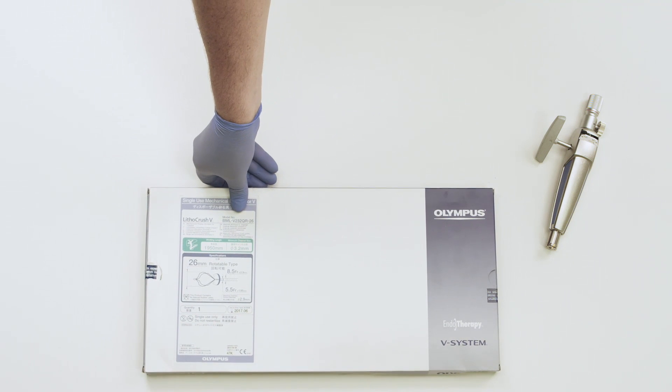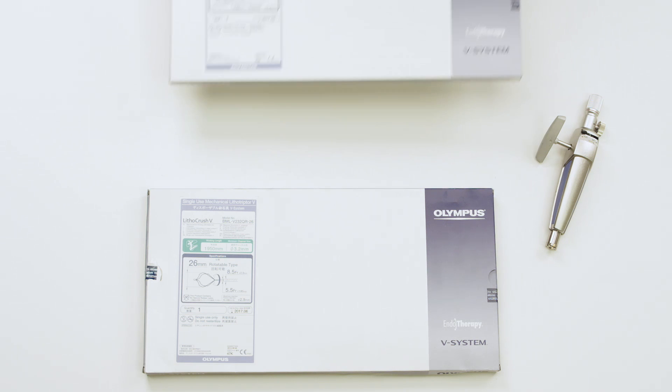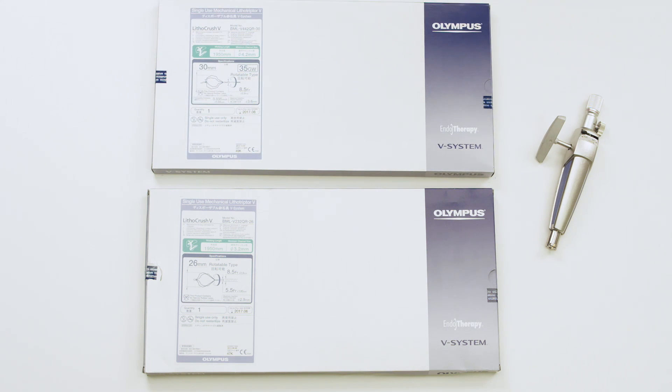Let's review the assembly of the Lithicrush V Mechanical Lithotripter. There are two different versions of the Lithicrush V. One is the rotatable bullet tip version. The other is the distally wire guided version. Today, we will review the distally wire guided version.